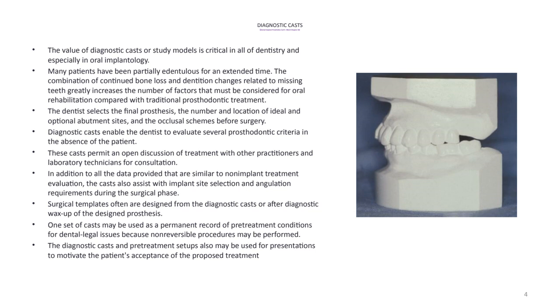One set of casts might be used as a permanent record of pre-treatment condition, and usually the doctor keeps those pre-surgery casts, like the diagnostic cast, for their records, and in case there are any legal issues regarding the treatment later on.